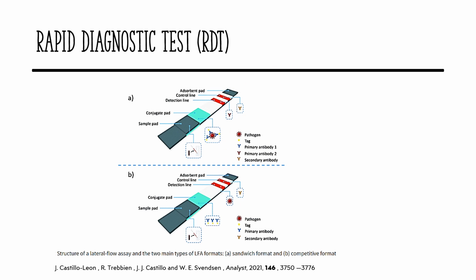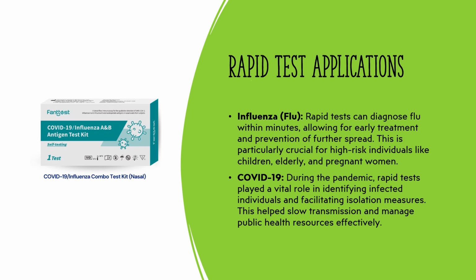Rapid diagnostic tests are point-of-need devices ideal for testing outside a dedicated laboratory space by personnel with minimal training. They are low cost, require no or minimum energy, and can provide results within 5 to 30 minutes. Rapid diagnostic tests are vital tools for rapidly detecting disease outbreaks, evaluating vaccine effectiveness, performing surveys of pathogen prevalence, and allowing remote diagnosis in organized workforces entering endemic areas. Now, let us look into some specific applications of rapid diagnostic tests in virology.